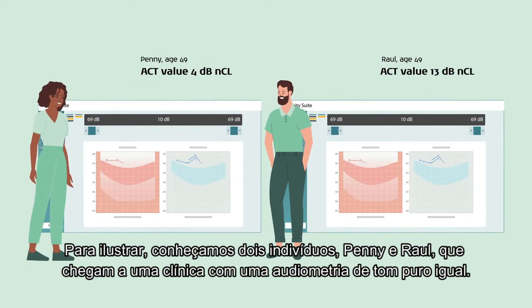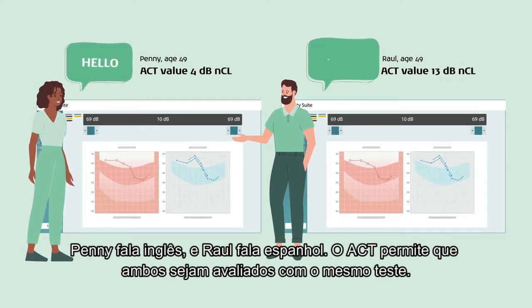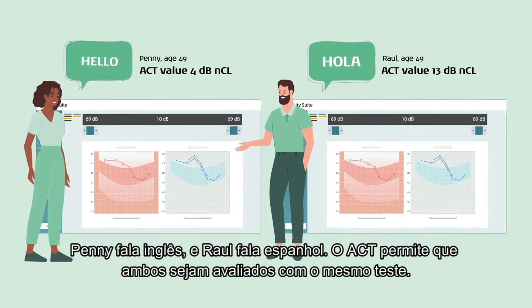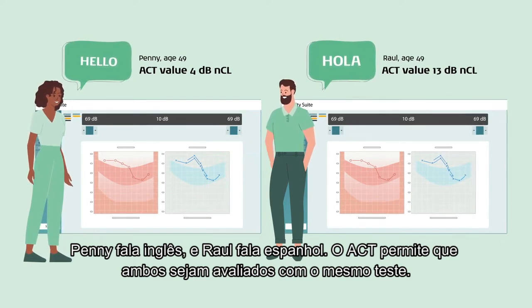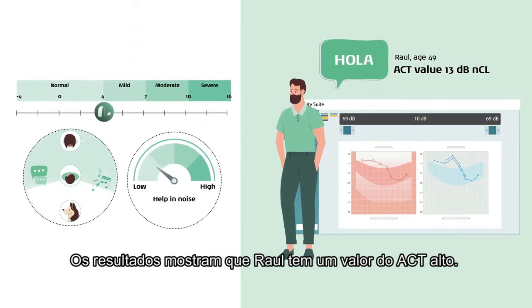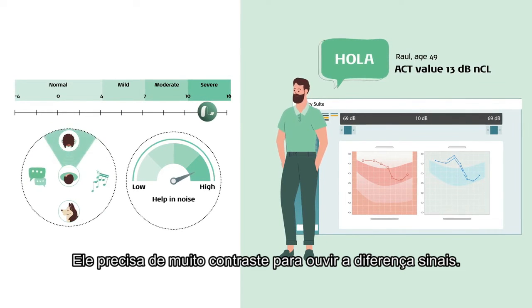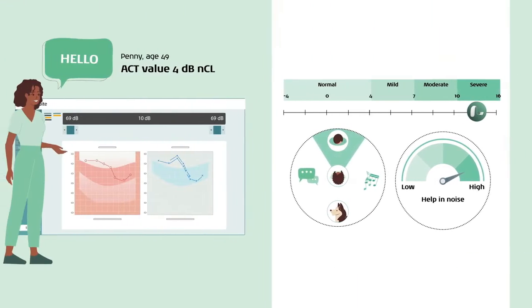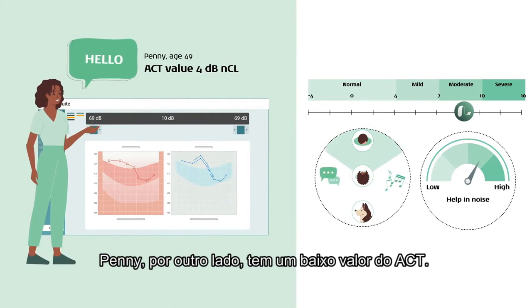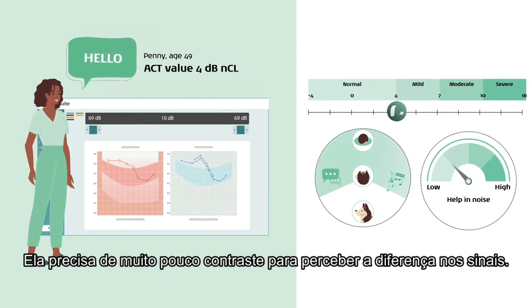To illustrate this, let's meet two individuals who arrive at a hearing aid clinic with the same Pure Tone audiogram: Penny and Raul. Penny speaks English and Raul speaks Spanish. ACT allows both individuals to be assessed using the same test. The results from the test show that Raul has a high ACT value. He needs lots of contrast to hear the difference in the signals. Penny, on the other hand, has a low ACT value. She needs very little contrast to hear the difference in the signals.